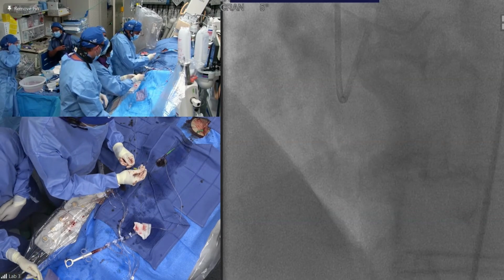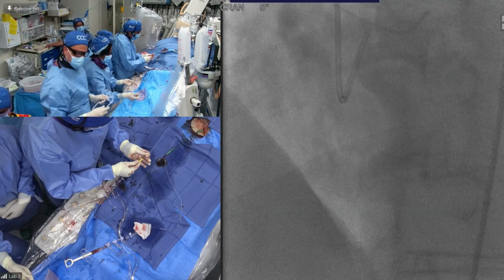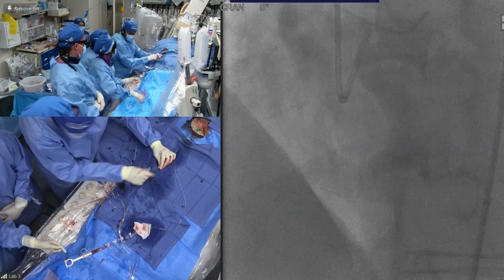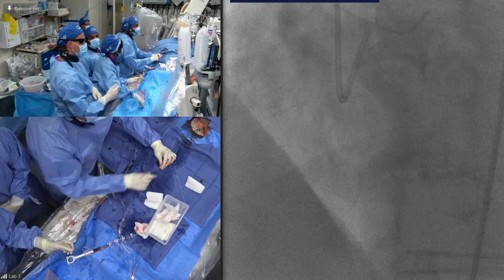We're going to go. Can we see, please, the side of case number 9? Case number 9, a 69-year-old male. Can we see that slide, please? Okay, go ahead, Dr. Sharma.